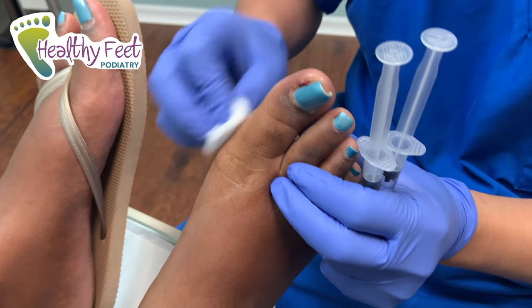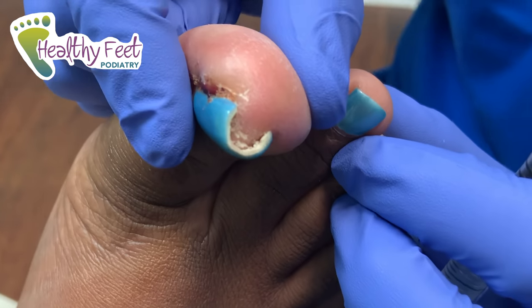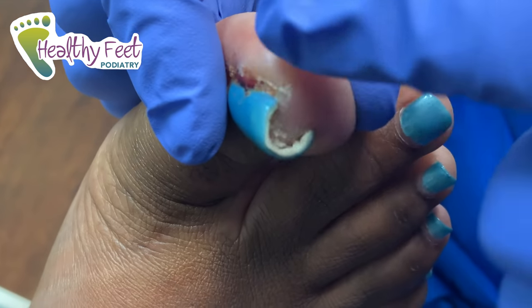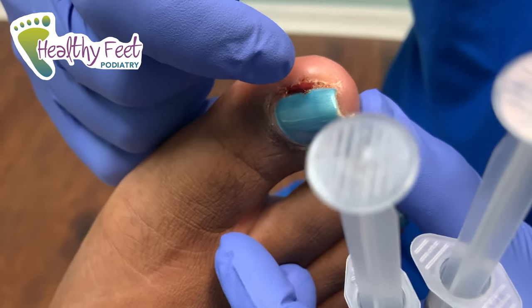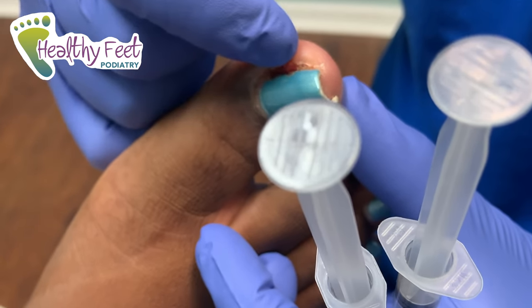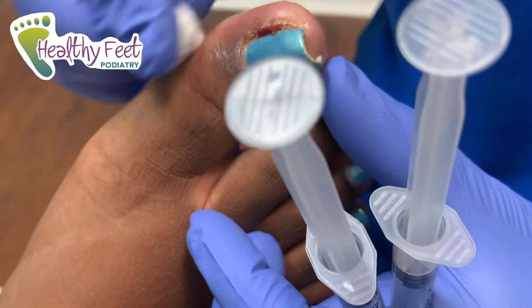All right, so we're looking at the toe here. See how her nail is — directly pinching into the skin. It's really curved in. It's causing the skin to push up against the nail, and it hurts. That was her going — I'm so sorry.